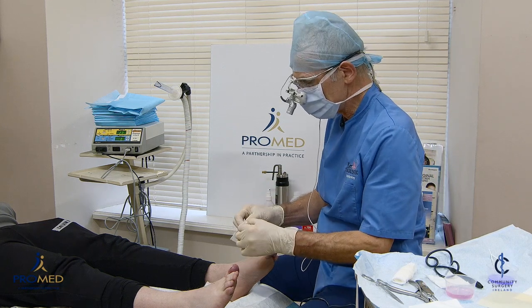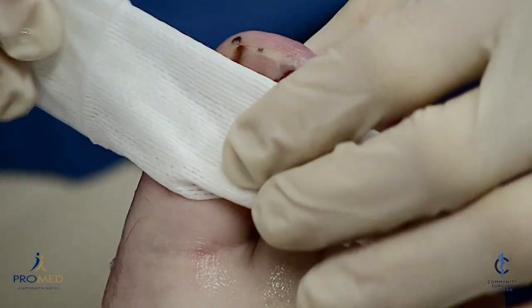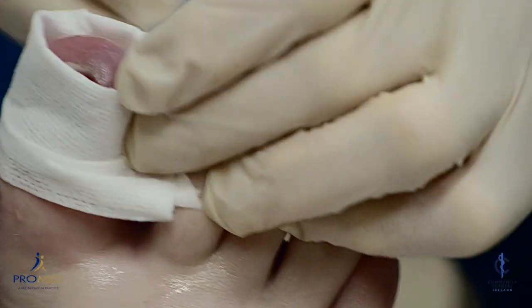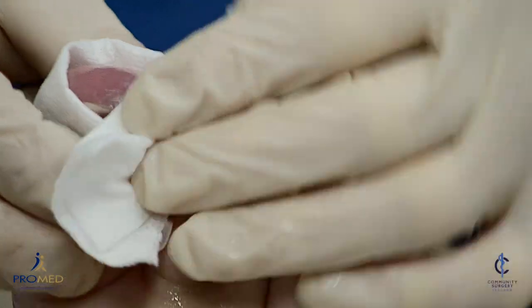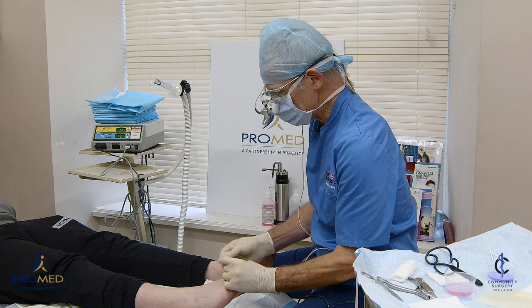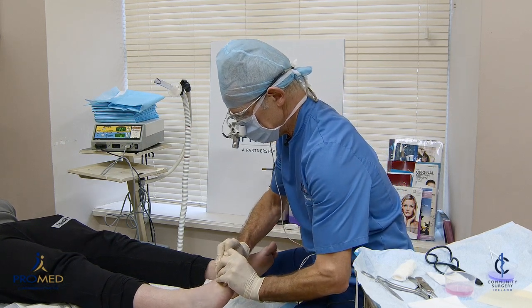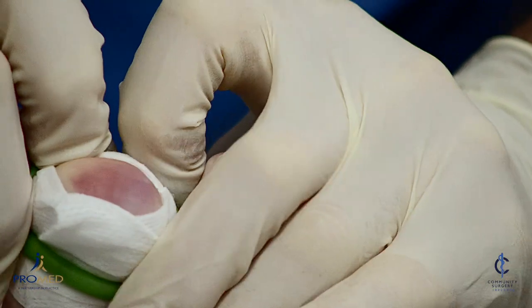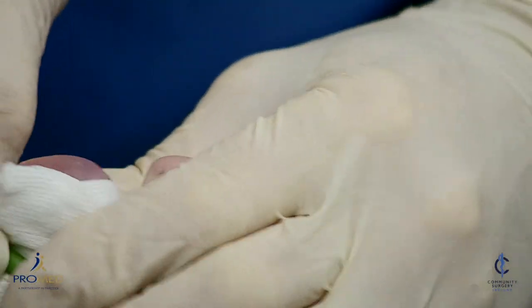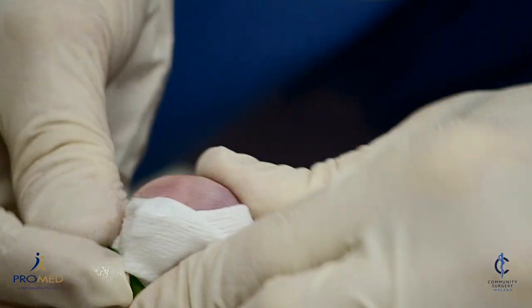If you're using phenol, it's very important to have a bloodless field. If you're using radiosurgery, equally you don't want blood in the way. So this is the easiest way to create a bloodless field — we put on a sterile gauze and then a digital tourniquet, and now that will make it a relatively bloodless field.